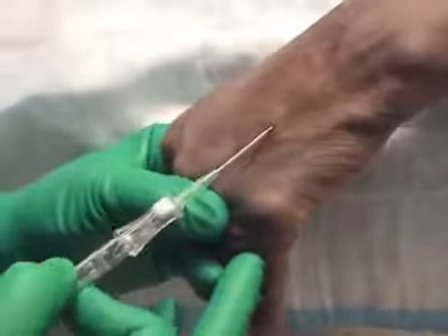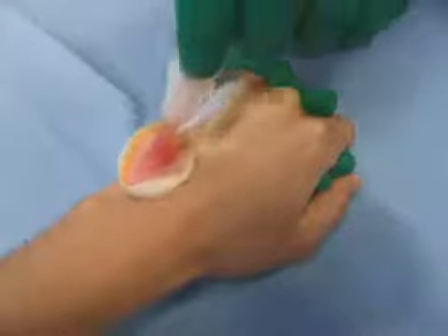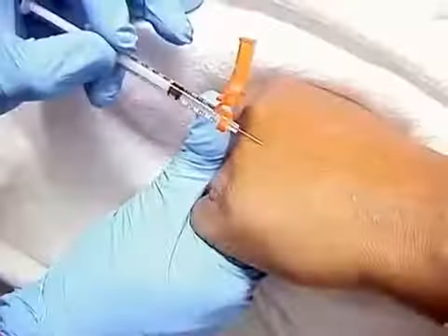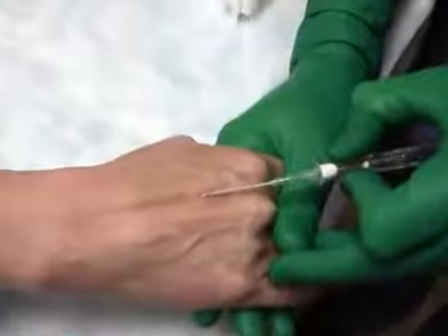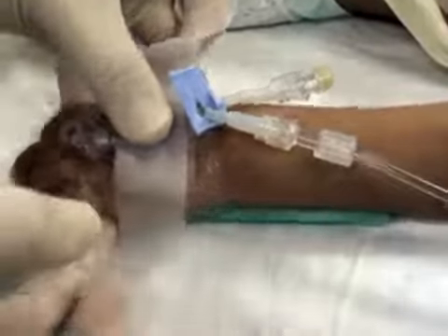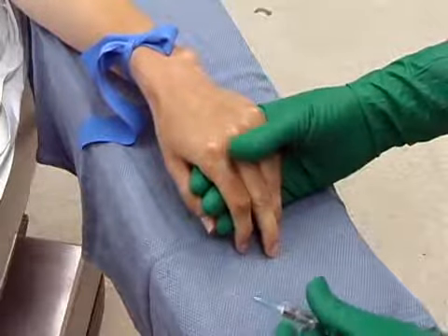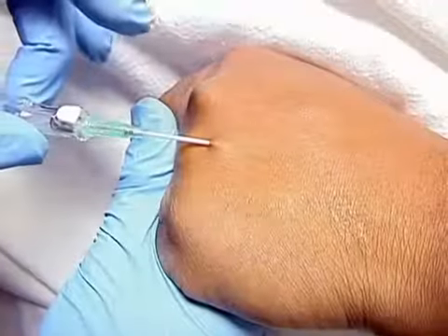The ability to obtain peripheral intravenous access is an essential skill for all physicians. Although considered one of the simplest invasive procedures, mastering this potentially life-saving intervention requires refined skills and experience. Cannulating a vein, particularly a small one, can be challenging. The purpose of this video is to demonstrate how to access peripheral veins using an intravenous catheter.